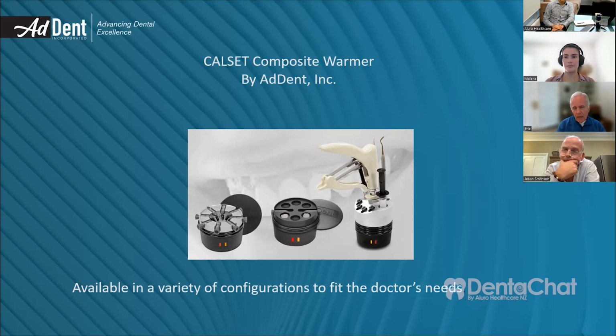And in some of the new research, they're trying to create a model of what the tooth is like. But even if they measure the temperature of their mold, the model doesn't have the same conductive properties as an actual tooth. So these are some of the things I'm going to be discussing at this meeting I mentioned earlier, to try to get to the next level. And it includes temperatures. For example, it may be possible to have a higher temperature setting, which would result in a higher temperature at the tooth surface, and might still be okay from a safety point of view. But these are things that we still don't know the answers to.